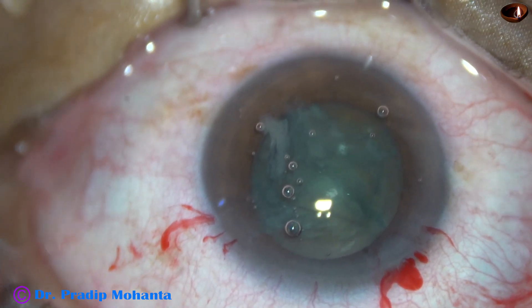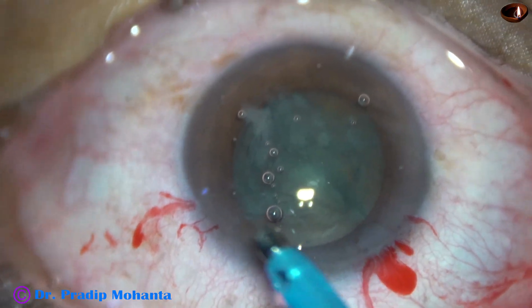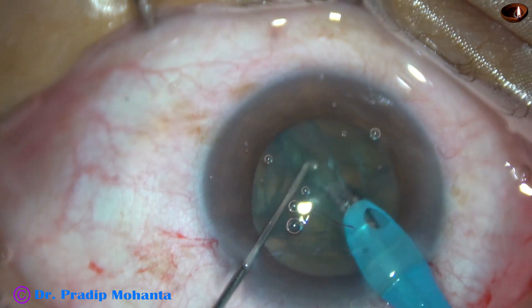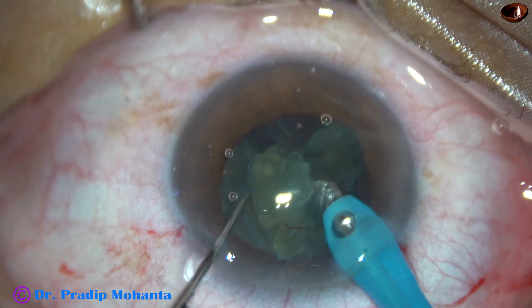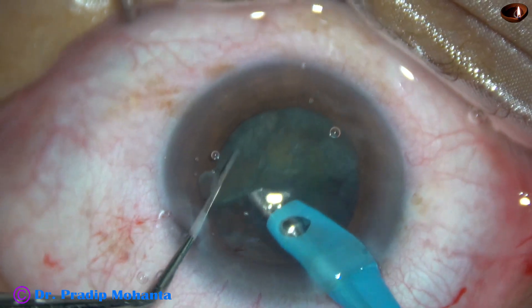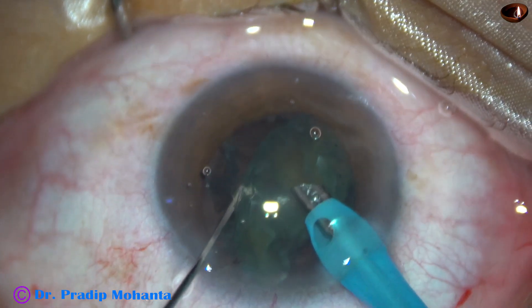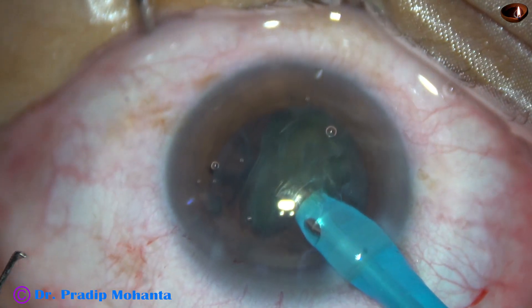Now the phaco needle is introduced. The exposed part of the phaco needle is checked — in soft cataract, it should not be much. Now each hemi-nucleus is just aspirated, emulsified, and removed. One half has been removed and now the other half — just start emulsifying. In no time, the nucleus gets emulsified and removed.